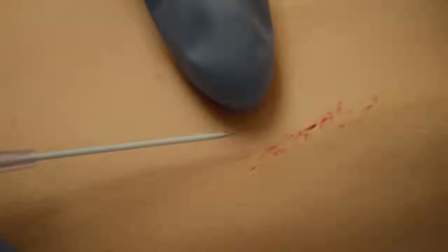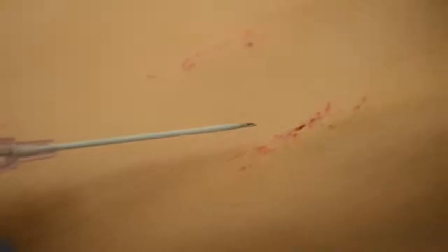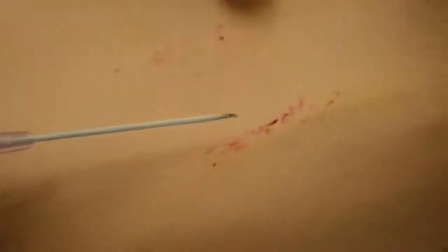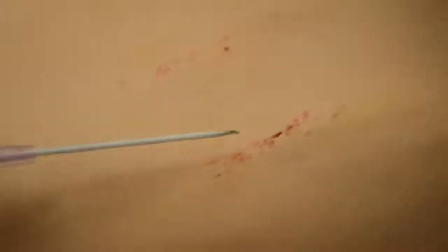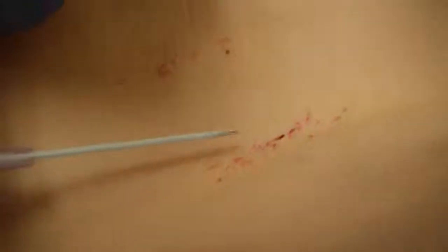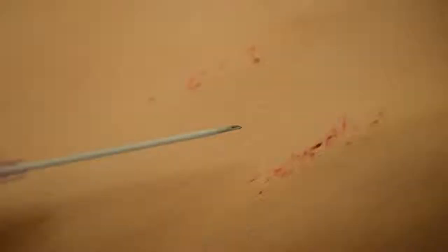That is why when we poke our patients, once we get a flash, we flatten our IV needle out and then advance it forward a little bit so that it's setting back onto the catheter. That bevel is creating an opening in the vein for the catheter, when you watch, to slide over the end of the needle.